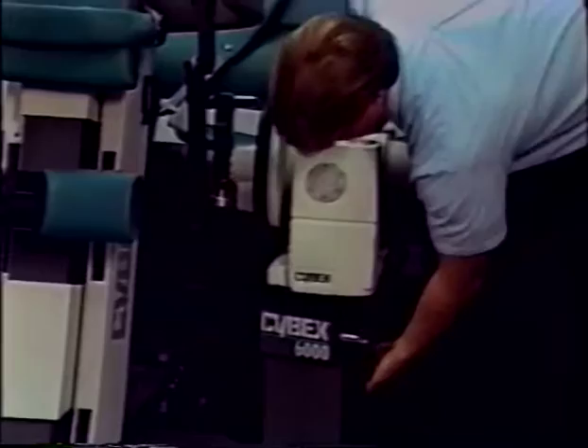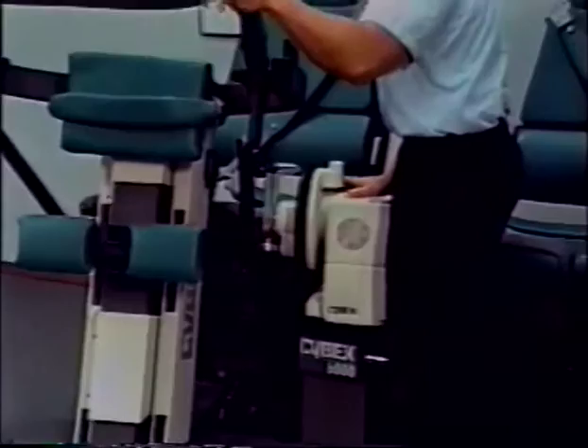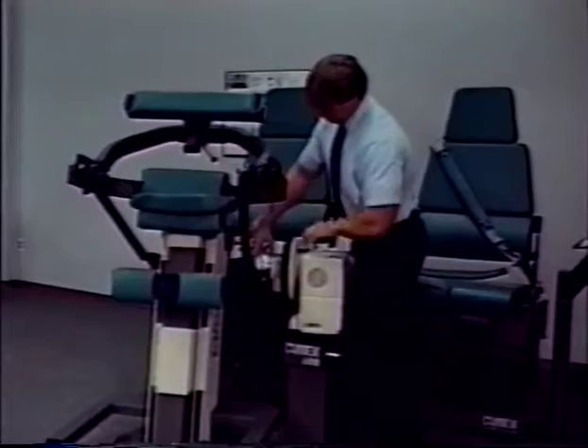With the 9/16-inch wrench, tighten the four hex head screws along the sides of the rear of the TEF modular component. Fully tighten the docking adapter locking knob.